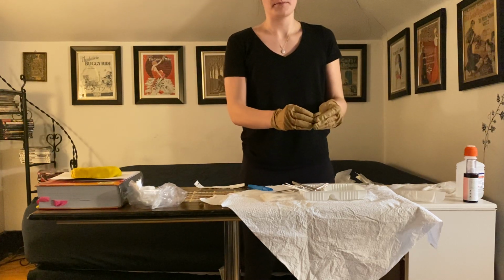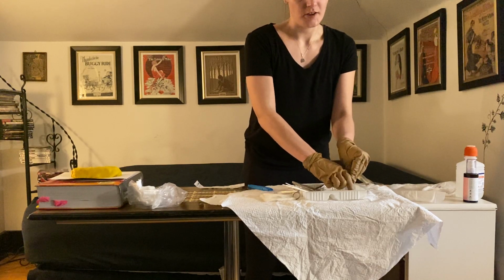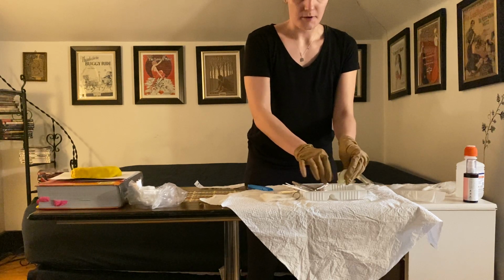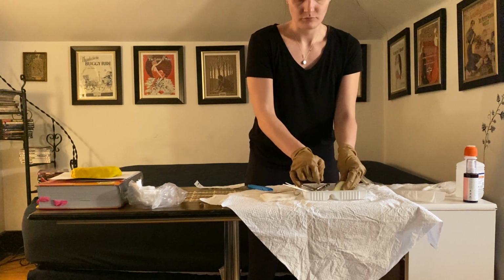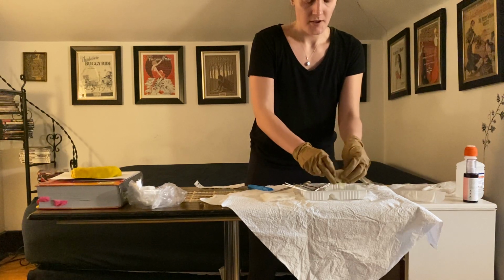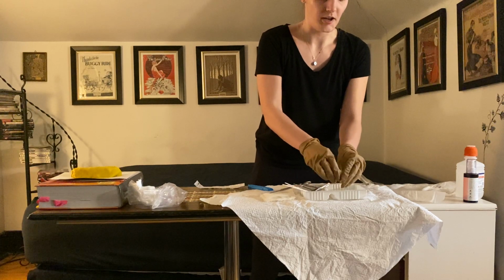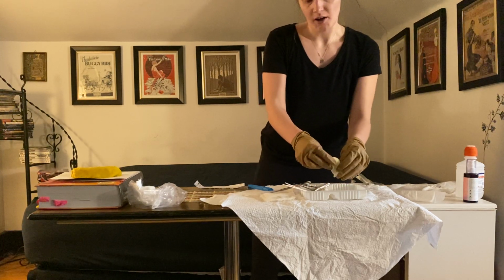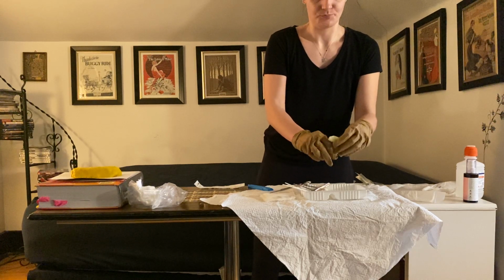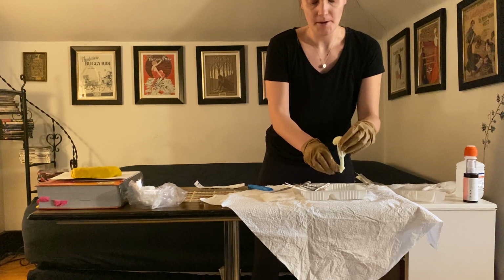So I'm going to pack with the pre-cut Curlex. Normally it wouldn't be pre-cut. I could cut it a bit so it's a bit easier to work with. So I cut a bit to make sure it's easier to work with, but it's already been pre-cut. And if there's any excess, I would want to make sure to cut that as well in real life scenarios. And again, being very mindful because I don't want any drops to get outside my tray.